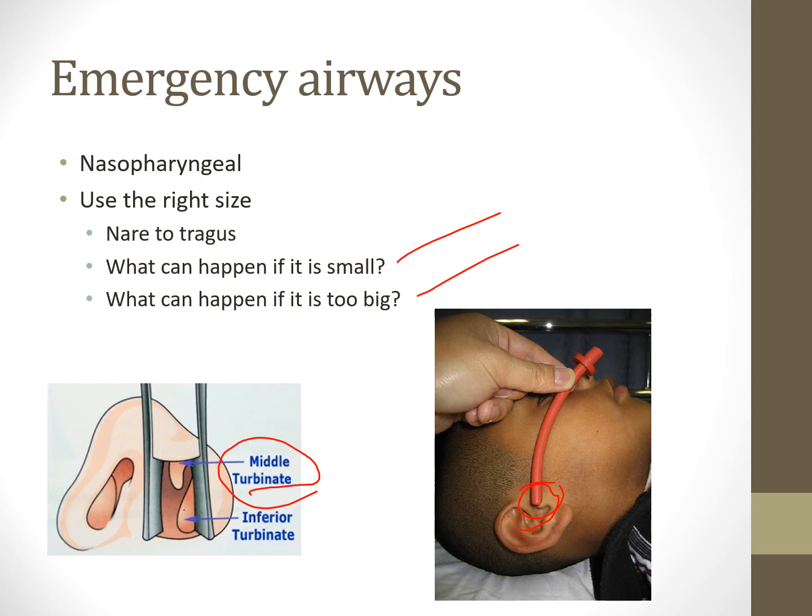Remember, I always put a little drop of saline or a little squish of saline in there just to help water things down, and then lube up the nasal trumpet, especially if you have someone that has like chronic AFib and is on blood thinners. Make sure you put some lubrication on that nasal airway. It can really, especially if their nose is dry, rip some tissue and cause a massive nosebleed. And that's not something you want to add to the current situation. And that's not something you want on your patient just in general.